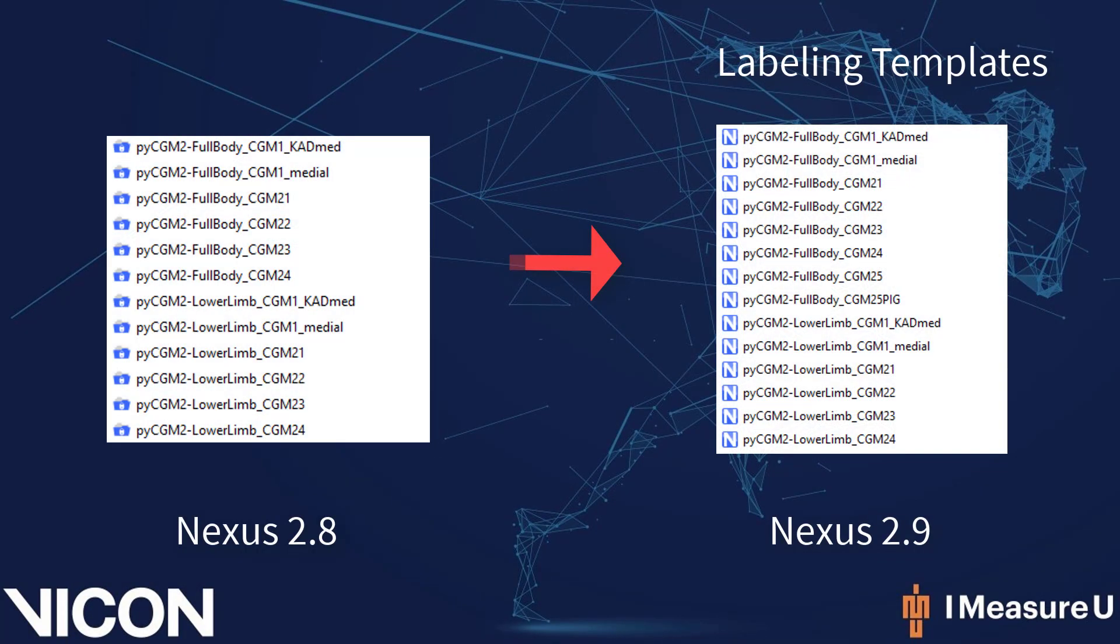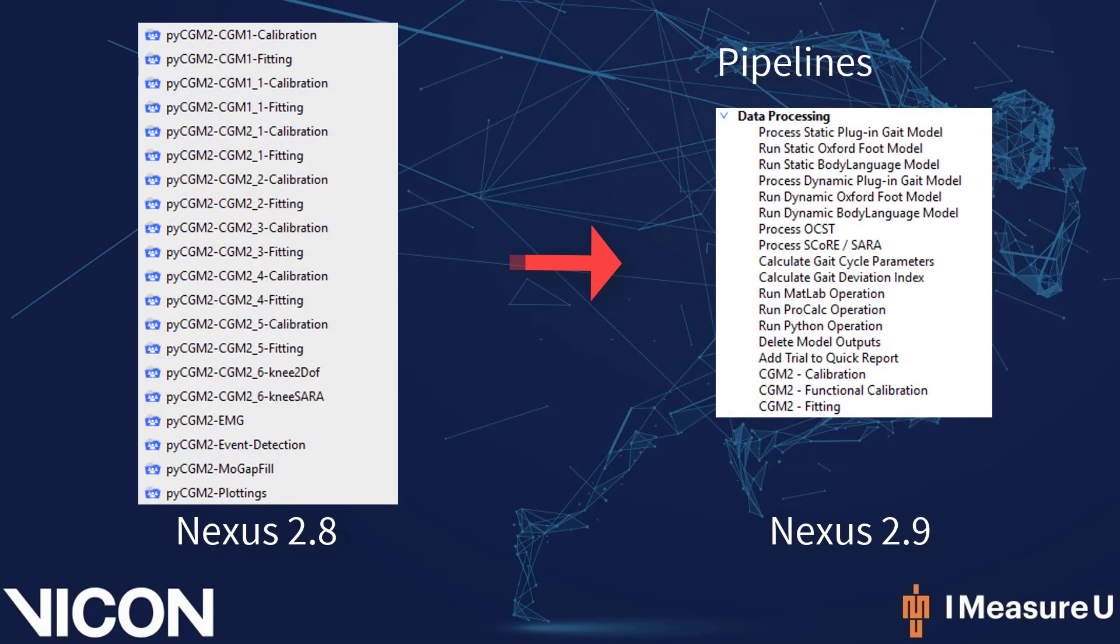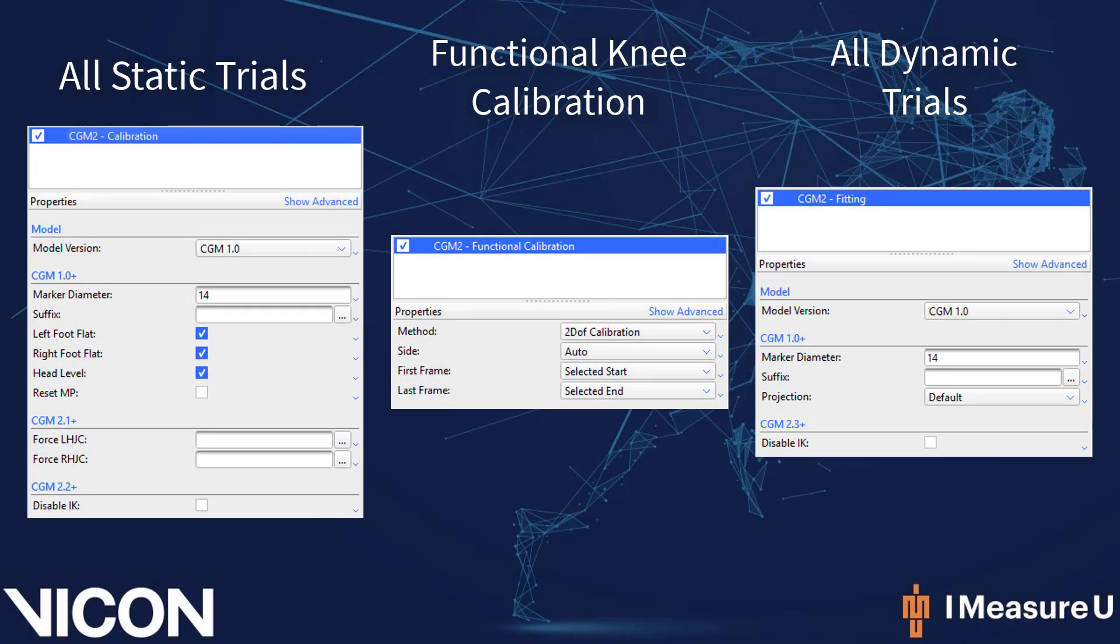Within Nexus 2.9, users will notice that all CGM2 labeling templates, or VSTs, have been set to default templates, and that all of the custom pipelines running Python operations have been replaced by CGM2 operations available under Data Processing. These three new operations are CGM2 calibration, which we would use for all static calibration trials, CGM2 functional calibration, which should be used for the knee calibration model, and CGM2 fitting, which will be used in all dynamic trials.